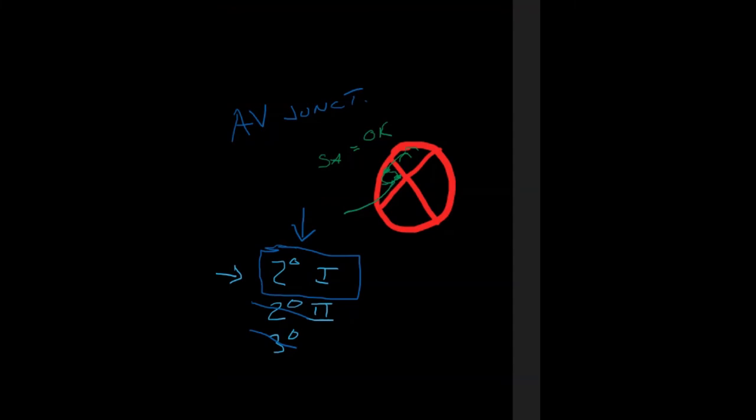It's going to be somewhere in this AV junction that is the problem. So what's happening is, think of the AV junction as snoozing. It's snoozing, or in this case, it's actually more lethargic. And what I mean by that is that it's not acting the way that it's supposed to.